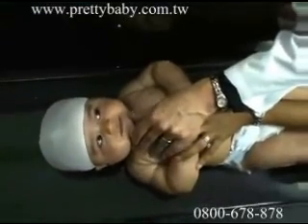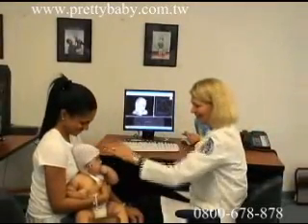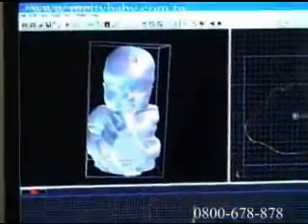The Star Scanner uses Class 1 EyeSafe lasers and was the first laser scanning system to receive clearance from the FDA for the use of scanning infants' head shapes. Scans are fast, taking less than 2 seconds to complete, and are extremely accurate, up to 0.5 millimeters.